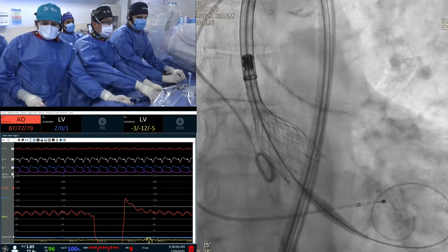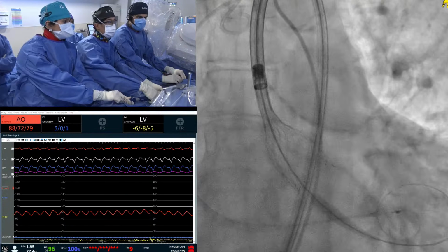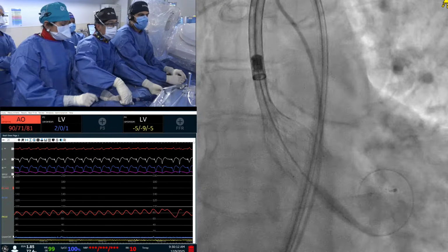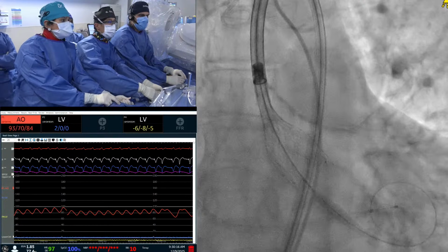After you deploy, Gilbert will show the audience why you said to leave the wire. Some people might want to leave the wire a little lower. So just say it was deployed first, but then after that, leave the wire.